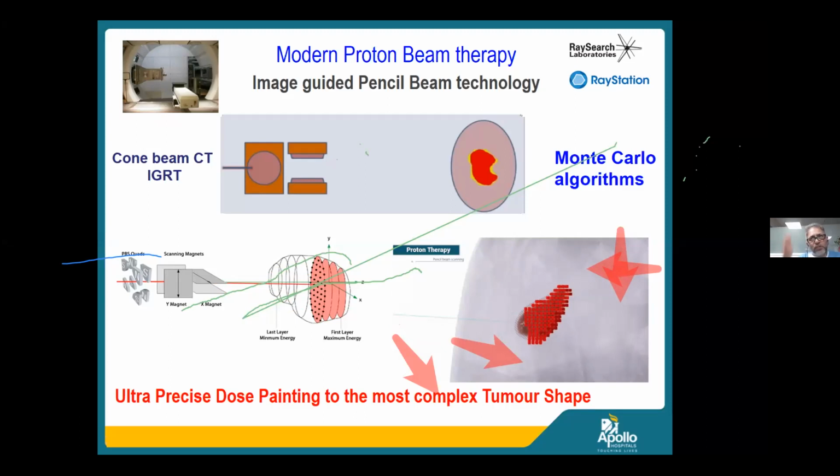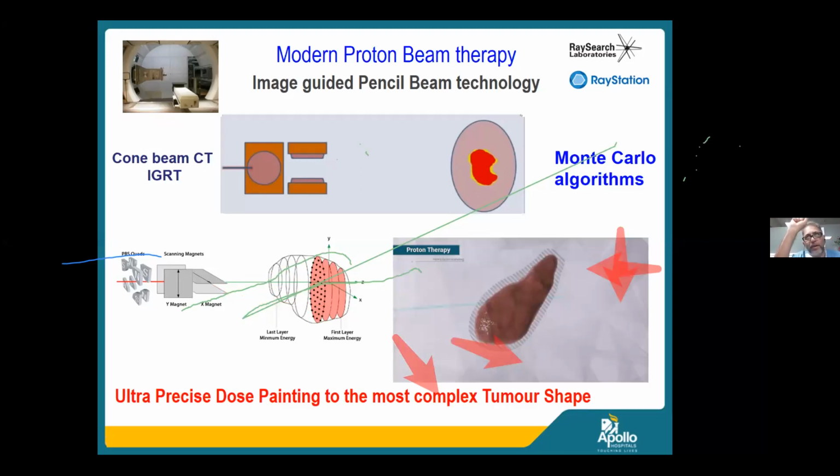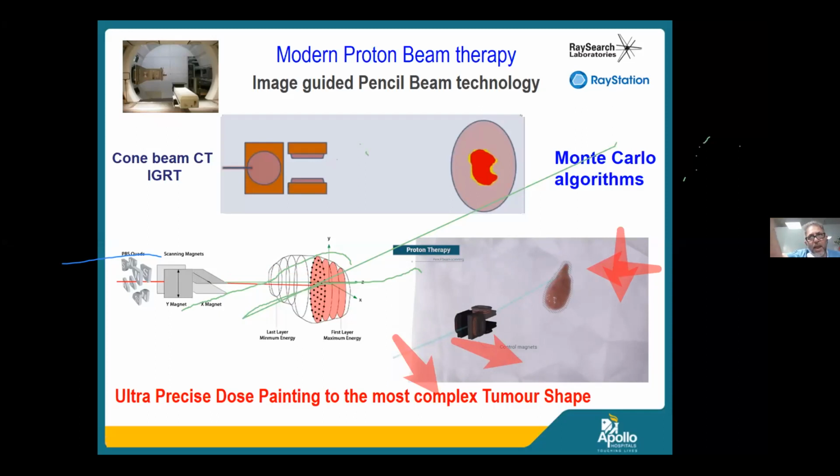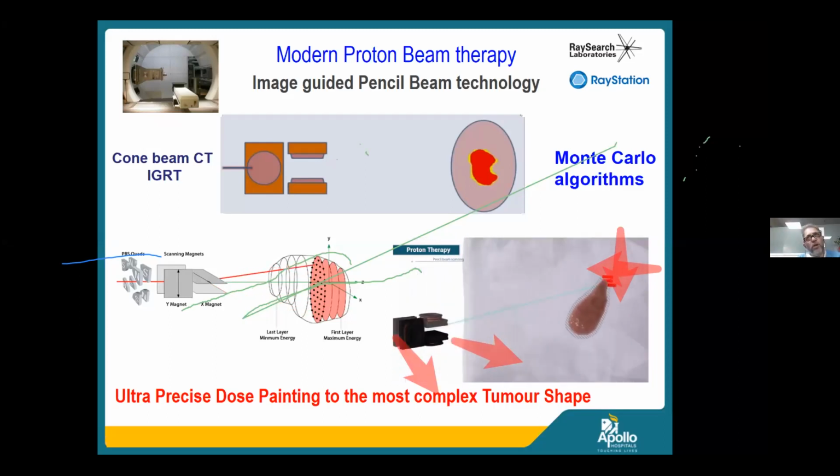It is like you slice a loaf of bread. A loaf can be sliced. So the farthest energy goes to the first layer, and then it keeps on going proximally. And the last layer is the minimum energy. And the computer does it for you, actually. And therefore, that is the second revolution that took place.